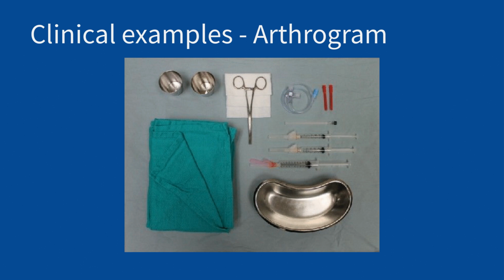The other piece with fluoroscopy is interventions, right? So arthrograms where you can actually inject contrast and better visualize the joint surface, which is not done as frequently anymore today with MRI, but certainly has a role in patients who are unable to receive an MRI.